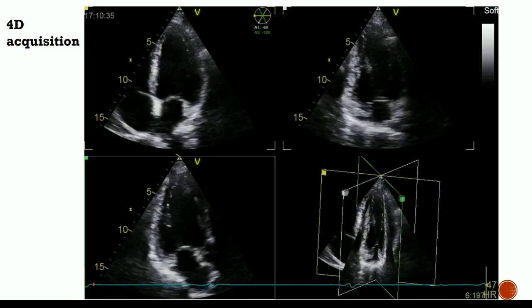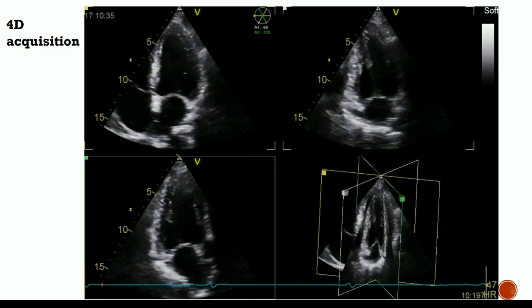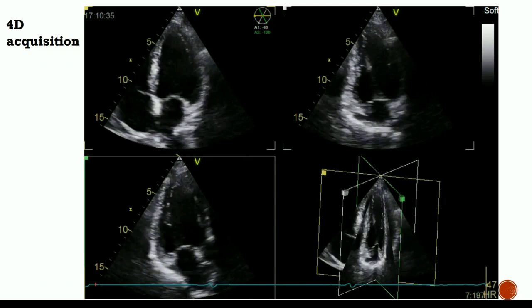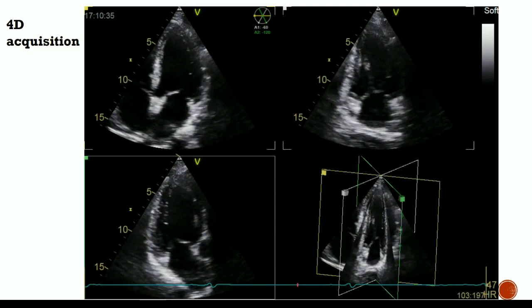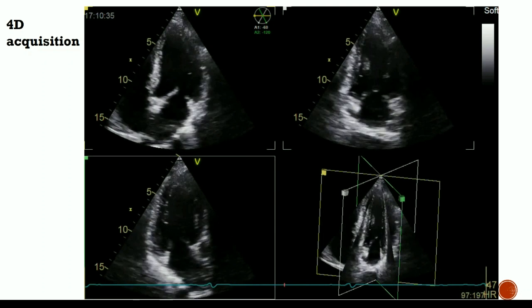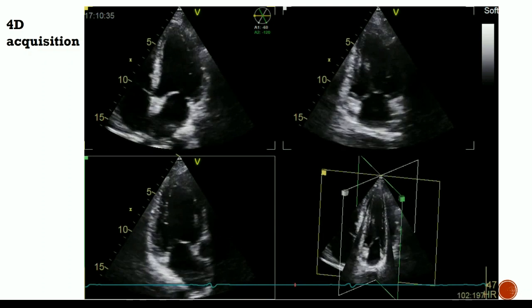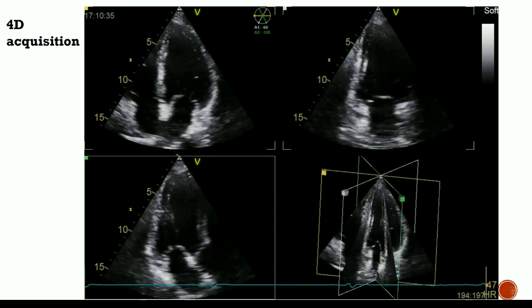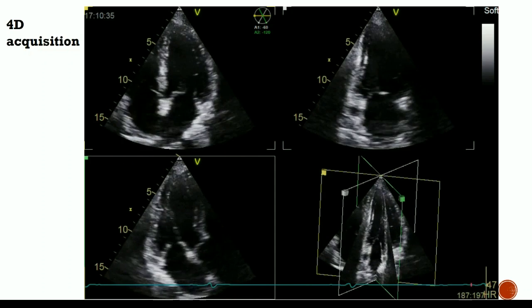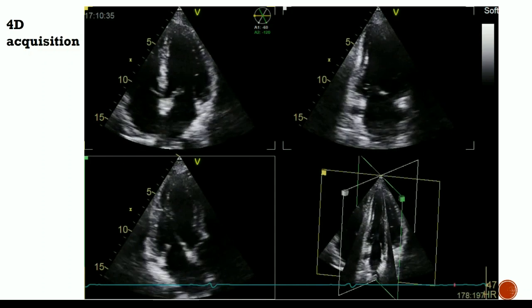Some of that is specific, so if someone else has more data, they can certainly speak up. But if you see a report with a global longitudinal strain of negative 20%, and another report a year later where it's dropped to maybe negative 18% or negative 17%, that's one of the issues with this modality overall: there are differences between software packages and vendors. There are studies that have looked at normal values, which change somewhat for each vendor.